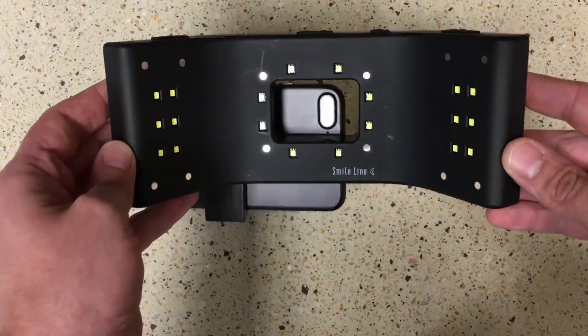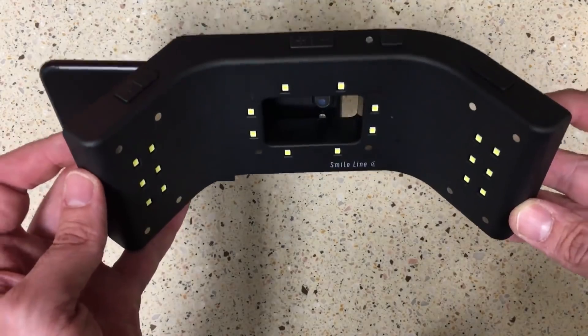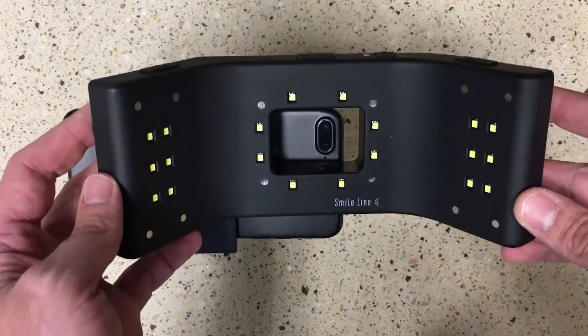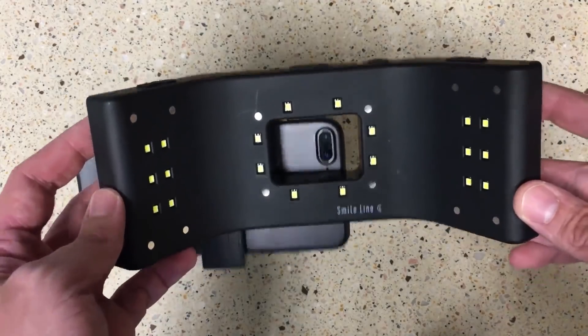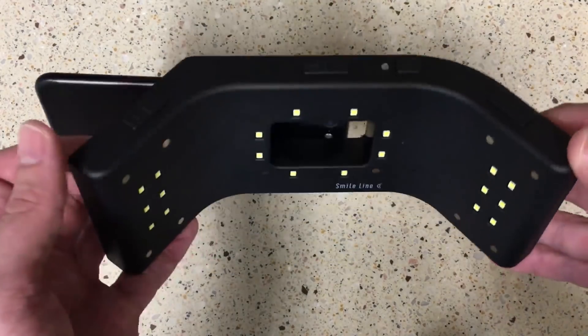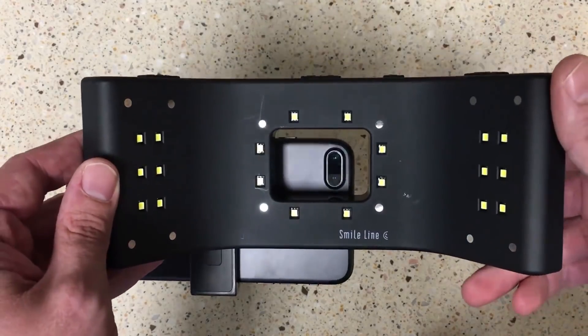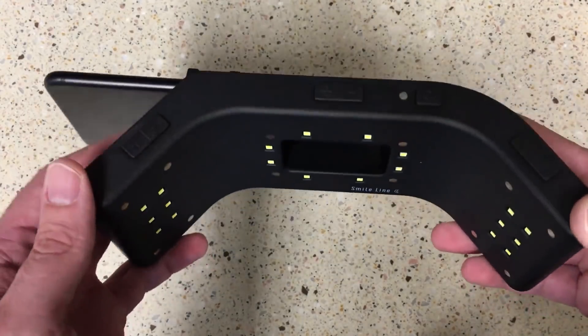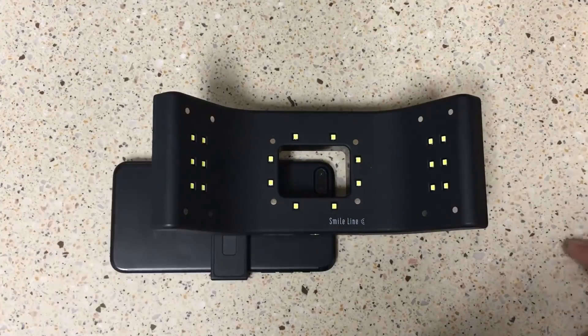The SmileLite MDP makes it really easy to get a great photograph for your lab with quality information they can use to achieve a great color and shade match — especially important when working with a lab that's not nearby. We all have a smartphone, so you can quickly get this out and going. Check out SmileLineUSA.com for more information. They make a lot of the Style Italiano products which are excellent, and this fits right in with getting great clinical results. I highly recommend the SmileLite MDP — it's going to make your life easier. Have a great day.